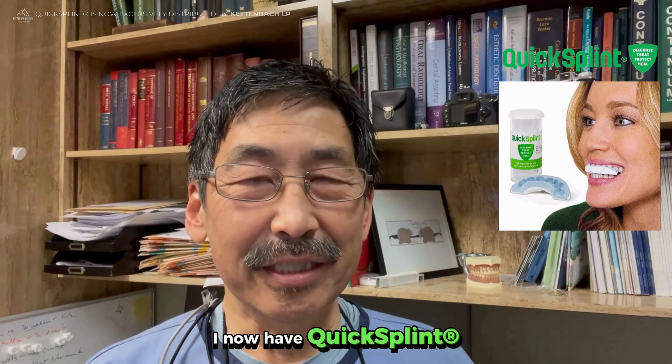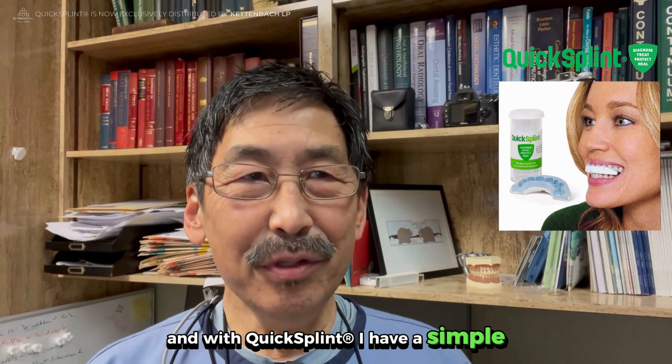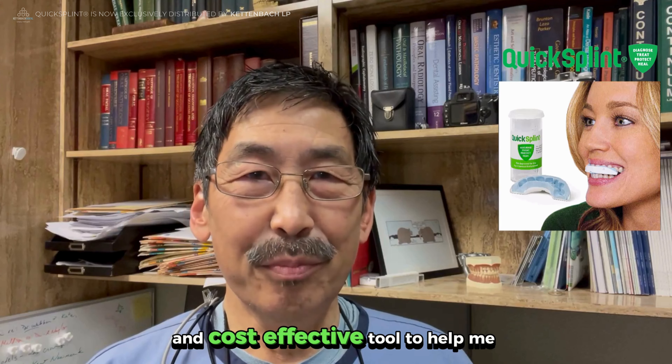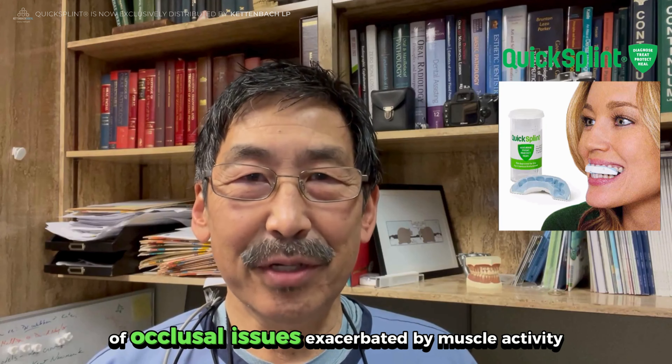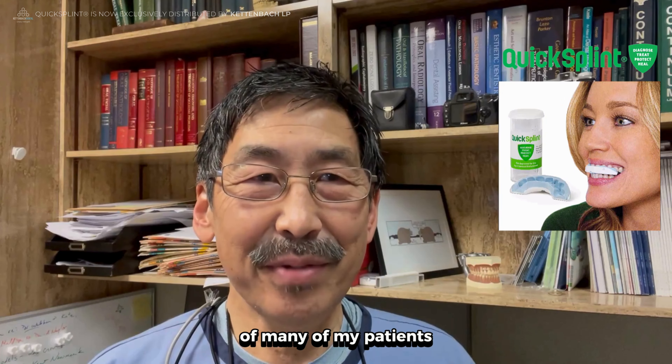Fast forward today — I now have the Quick Splint. With Quick Splint, I have a simple, efficient, and cost-effective tool to help me with the diagnosis and management treatment of occlusal issues exacerbated by muscle activity that exceeds the adaptive capacity of many of my patients.